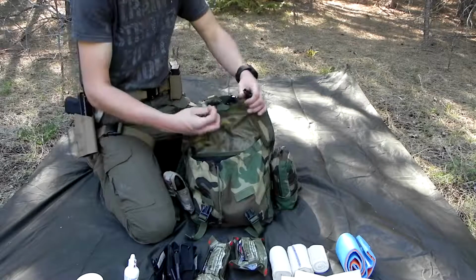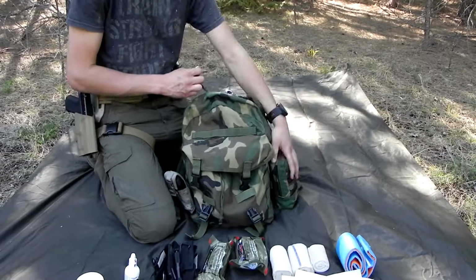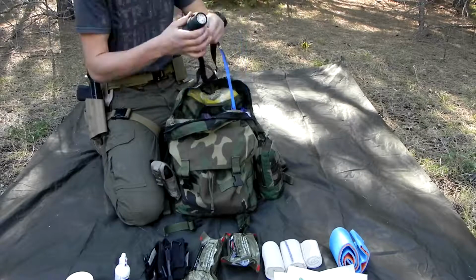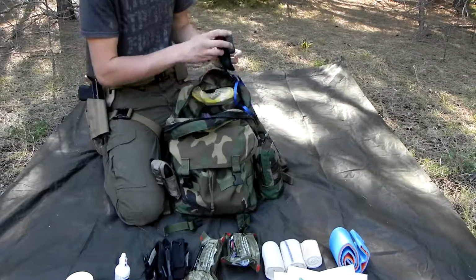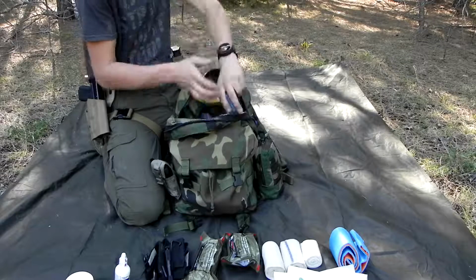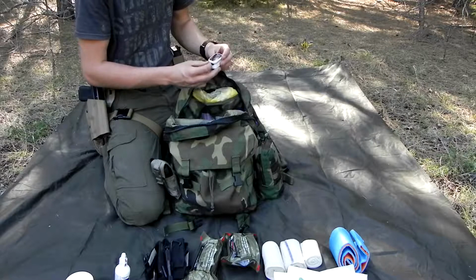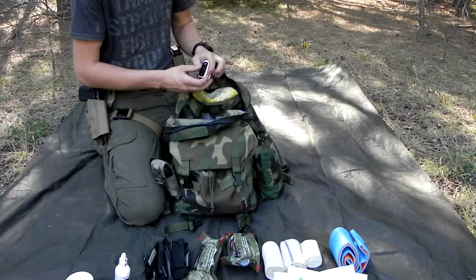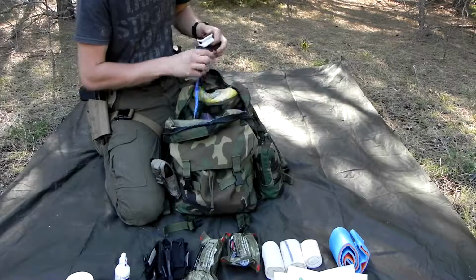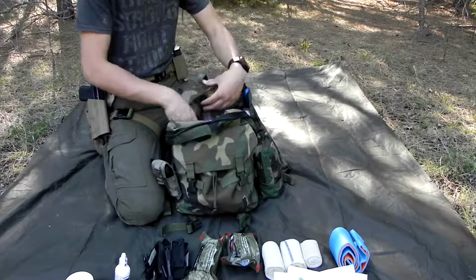Yeah. Alright guys, then we'll move off into the main compartment and the small IFAK on the side. The first thing I have in here, I have this lanyarded, as well as this. I have a headlamp and a pulse oximeter. It's a quick, easy thing to be able to use to check how you're doing, blood O2 concentration, or O2 saturation, that's what I meant to say. And that is lanyarded, so I don't lose it. And it's an easy grab. It's right at the top, and it's blue, and so is the light in case it's dark.